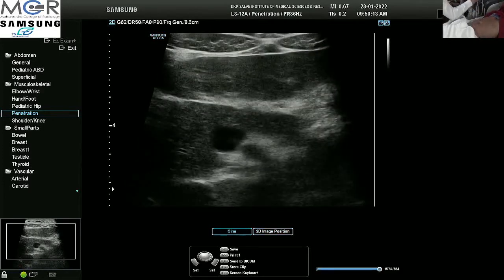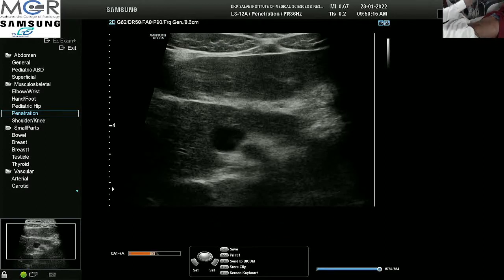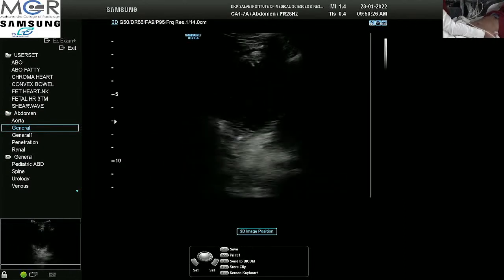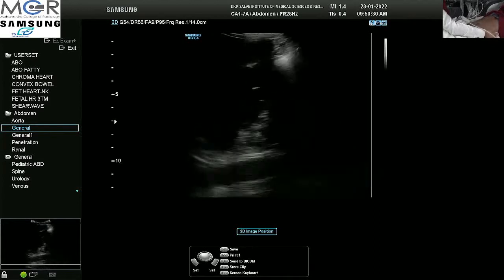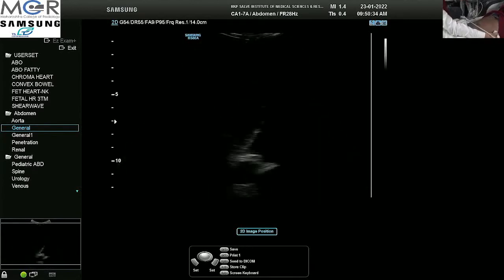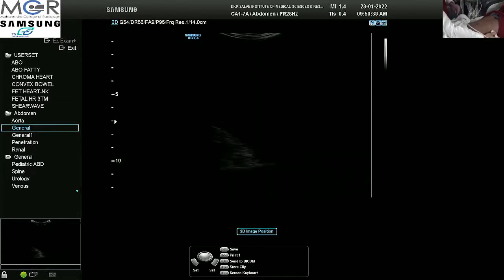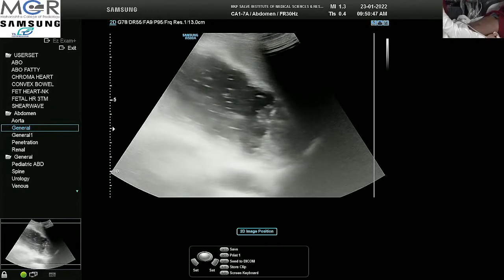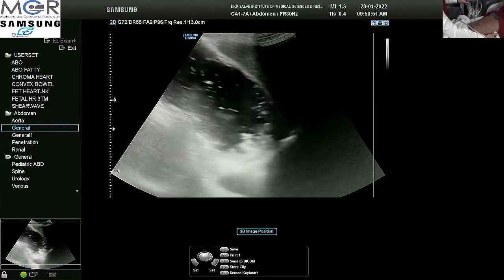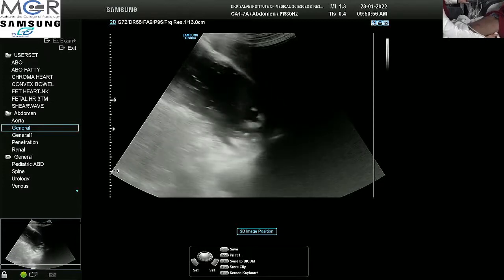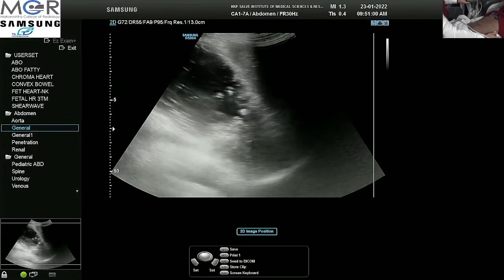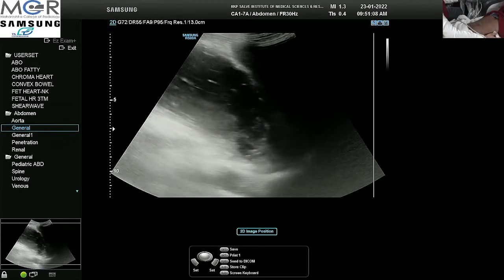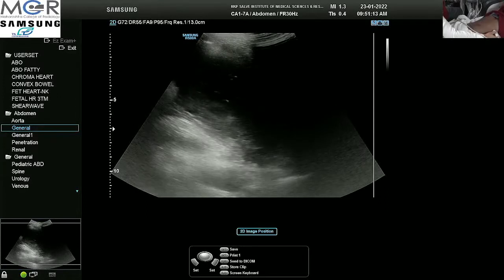I will go and see the fundus of the stomach. The fundus can be seen through the spleen by scanning in the left mid axillary line. I am scanning through the spleen — this is the spleen, and I am looking at the fundus of the stomach. If there is any fluid collection or pseudocyst here and we are confused whether we are looking at the fundus or a pseudocyst, we give a small sip of water to the patient and look for moving echoes within the fundus. If we are able to see the moving echoes, it confirms that we are looking at the fundus of the stomach.